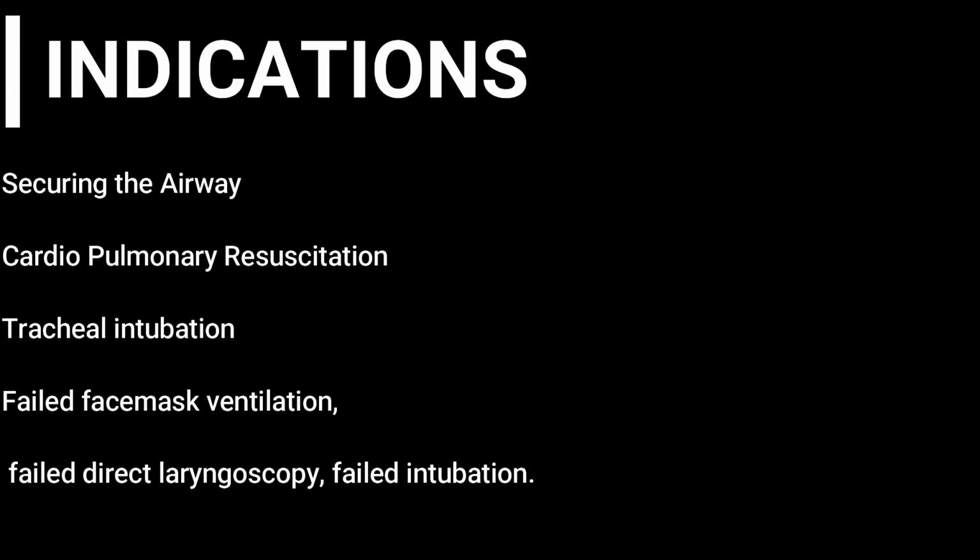Indications. It is used in securing the airway in CPR, in tracheal intubation, in failed face mask ventilation, and in failed direct laryngoscopy or failed intubation.